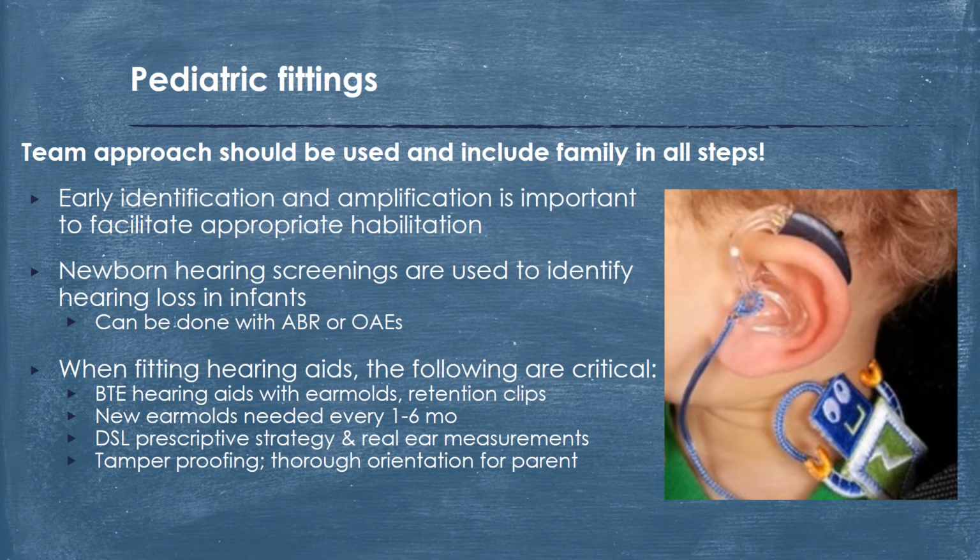We also want to include the speech language pathologist because I would say 95% of kids with hearing loss are seeing speech pathologists. And so we want that speech pathologist to be able to troubleshoot the hearing aid, listen to it and make sure it's working properly, and help us, as a team, to monitor this child's improvement in speech and language changes post hearing aid fitting.